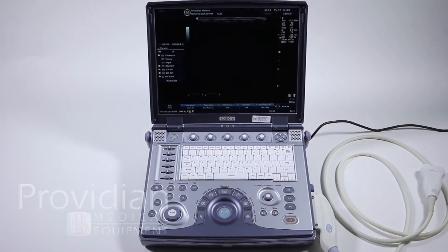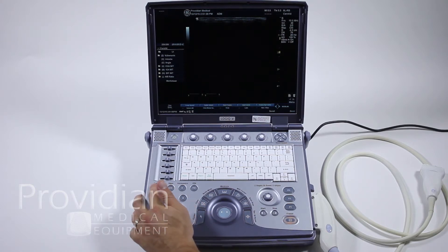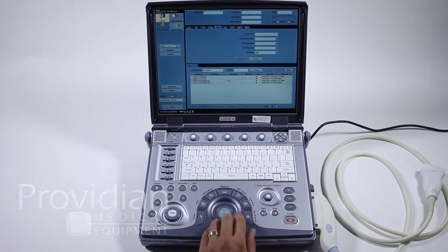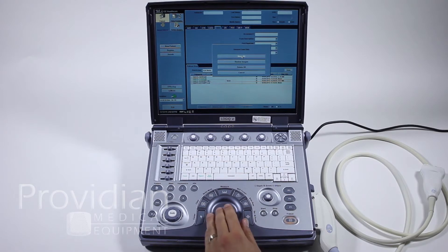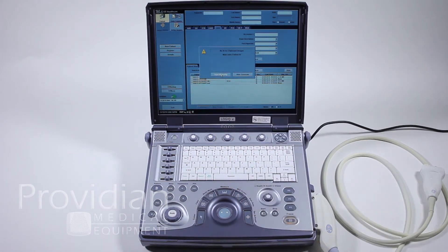Before we get started with 2D imaging, it's important you assign a patient. Remember in the last video I saved two images and they're not assigned to a patient — those could be deleted, and you don't want to do that if you forgot to enter a patient name and redo that scan. We'll start by clicking the patient key and clicking new patient. It's saving unsaved exam data — you can review, delete, or store the images. I'll go ahead and store them all, and it's saying no ID for clipboard images.